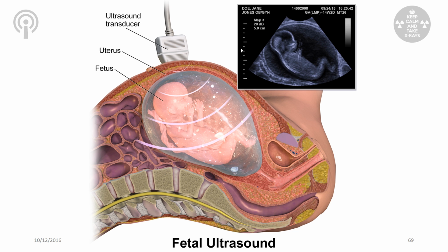So you have a piezoelectric ultrasound transducer, for the technical term. The cool thing about the transducer is that it uses a piezoelectric material. Piezoelectric means that if you pass electricity through this material, it generates a sound pulse. And when the sound wave passes back, it also creates an electrical charge. So it can be used in both ways, and that's why it's called a transducer. We fire out a ping and then listen for the ping to come back, and based on how long it takes to come back and how strongly it comes back, we can produce a picture from that.